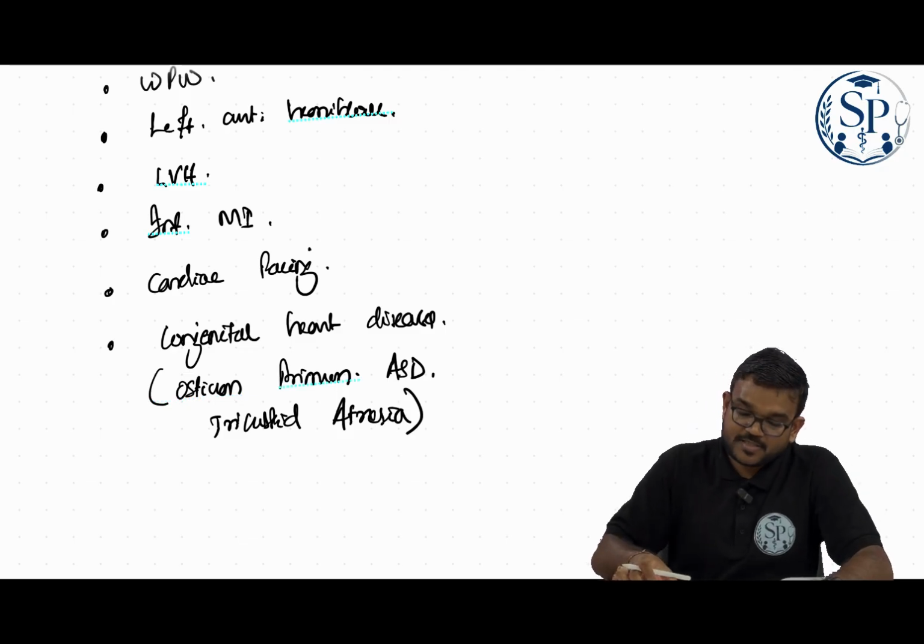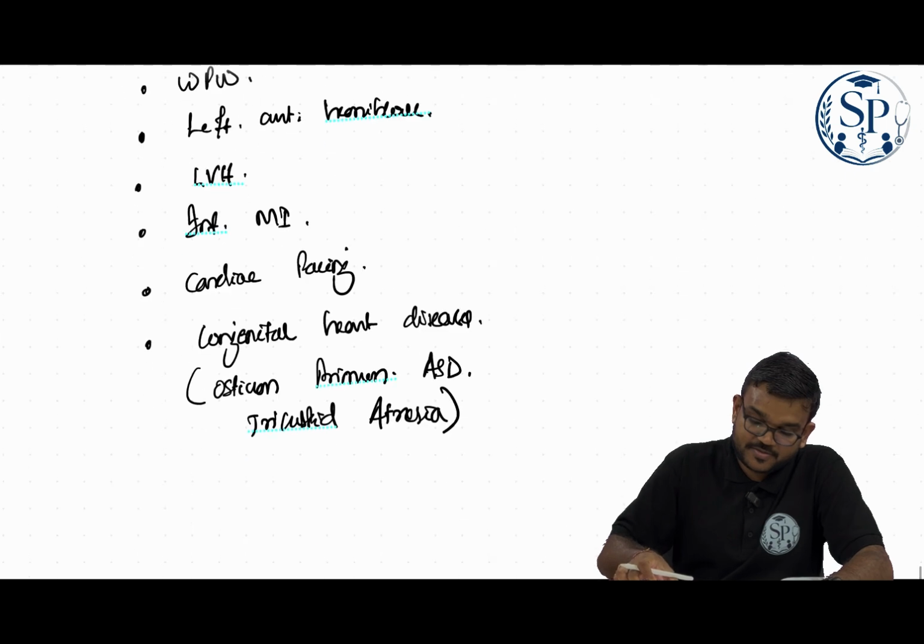Okay, so these are the causes of left axis deviation.